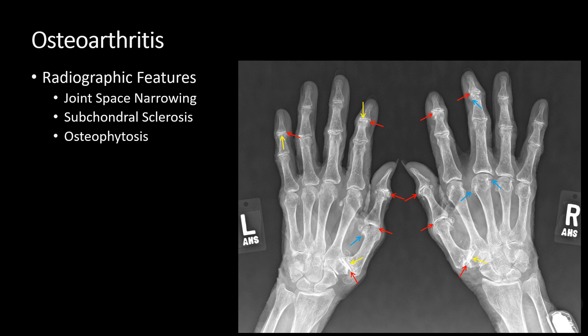Now I'll discuss osteoarthritis. The red arrows represent joint space narrowing throughout the hands and wrists, with the most severely involved joints identified. This distribution is very typical for osteoarthritis. Notice how the DIP joints are involved, unlike rheumatoid arthritis. The yellow arrows represent subchondral sclerosis — notice the increased periarticular attenuation, in contrast to the periarticular osteopenia seen with rheumatoid arthritis. Finally, the blue arrows represent osteophytes.